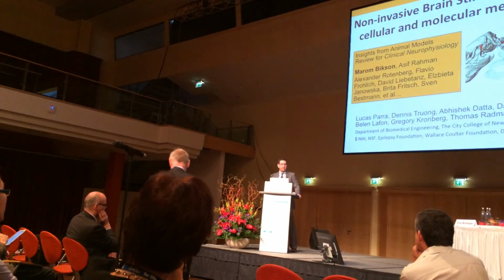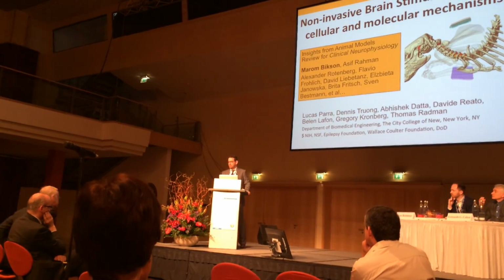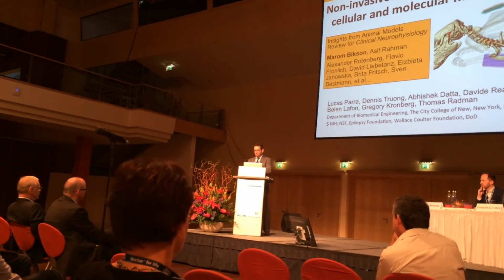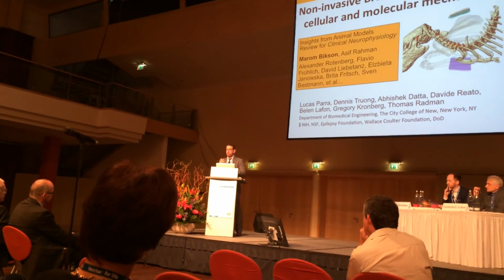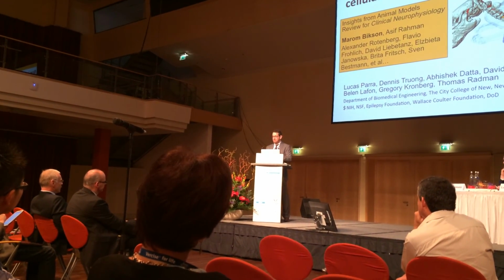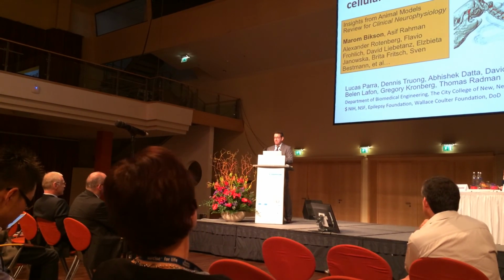We've certainly heard today, especially in Michael Nitsche's talk and John Rothwell's talk, the complexity, right? The more people are digging into this issue at the human level, the more they're finding out that anodal isn't simply excitatory, cathodal is not simply inhibitory, and that there's a huge dependence on the ongoing functional activity. To some extent, those questions may be teased out at the clinical level, but yes, I hope that these kinds of models may help inform that.